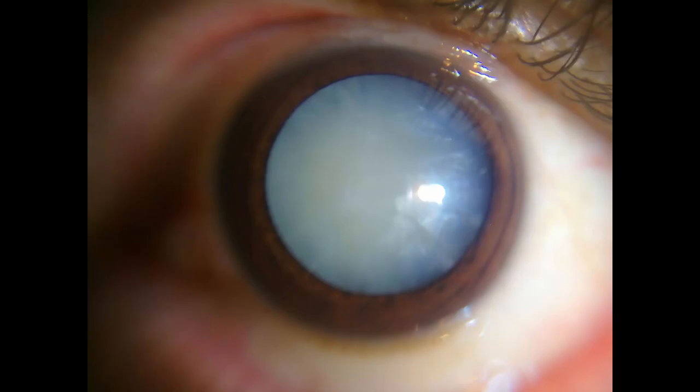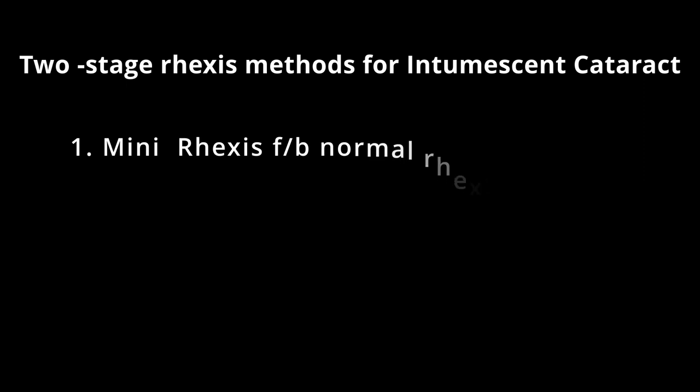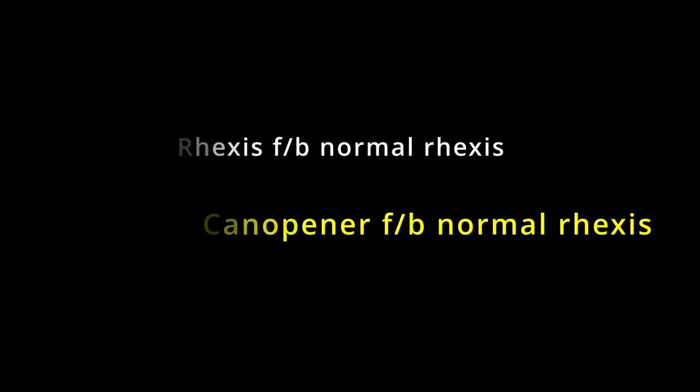In this video series on management of intumescent cataract, we previously discussed the technique of mini-rhexis. Now we will demonstrate the use of a small can-opener followed by a normal-sized rhexis.